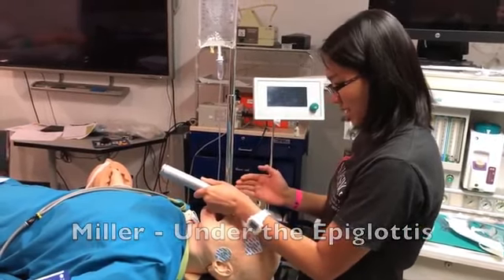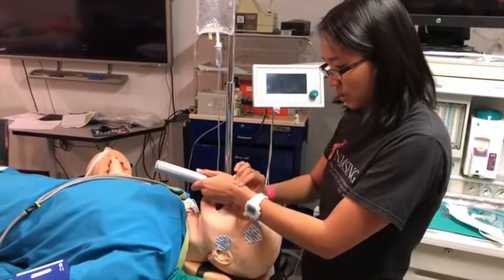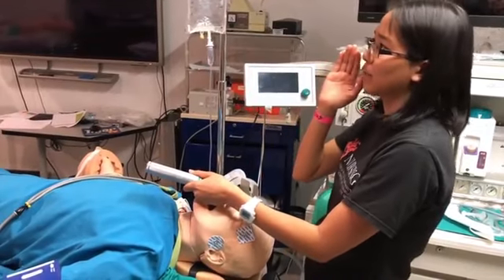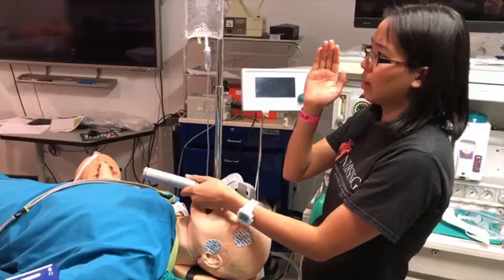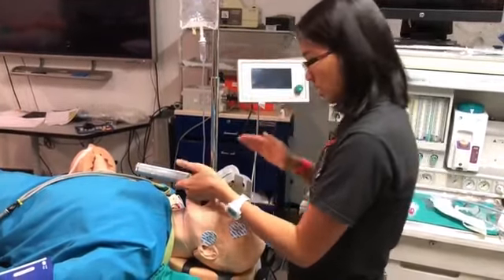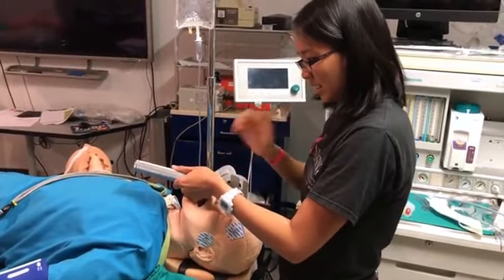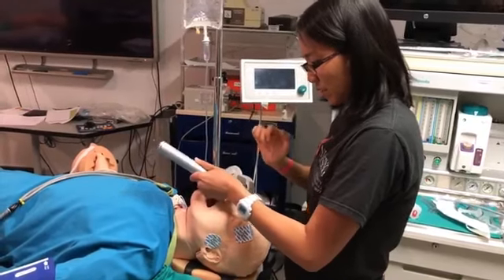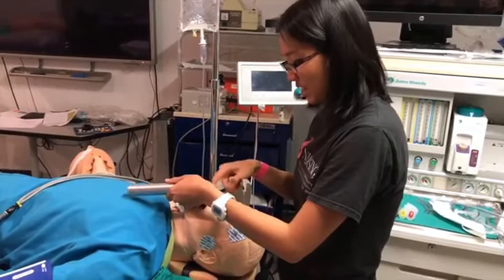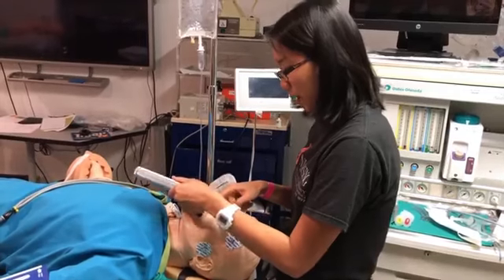When you are in the correct position, you want to keep your wrists in a neutral position and do an upward forward movement, so aim for the upper corner in the opposite side of the room, like this angle. If you rock back and do flexion, extension of your wrist, it actually can damage not the mannequin's teeth, but the patient's teeth. That's really bad. Dental damage can be one of the problems of intubation.